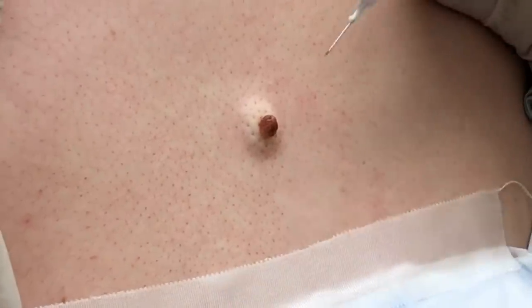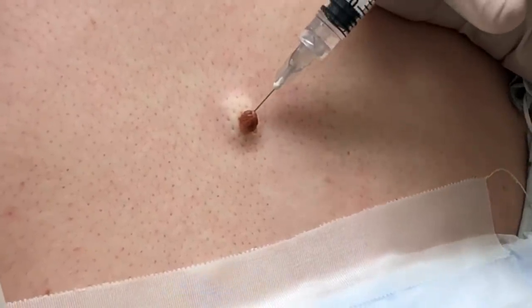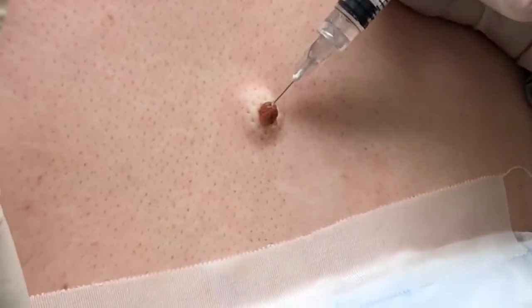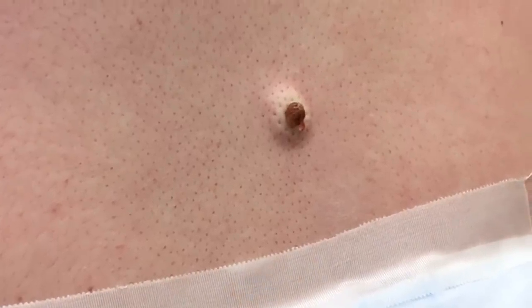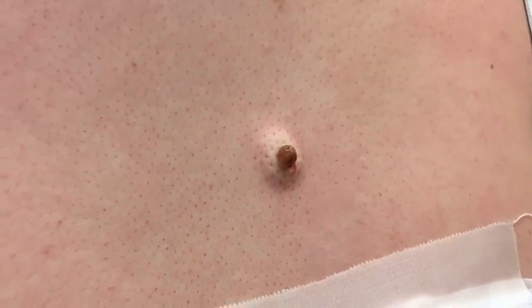The whole mole changed colors. Yeah. Put a little bit more in for you. There we go. All right. So what we're going to do is what's called a punch biopsy. This is a little tool that we use to do biopsies. And in this case, it's large enough that we can actually do the biopsy and remove the mole at the same time. Pretty cool, huh?